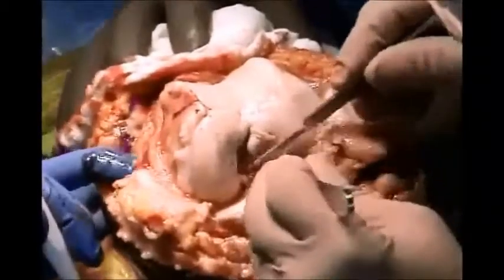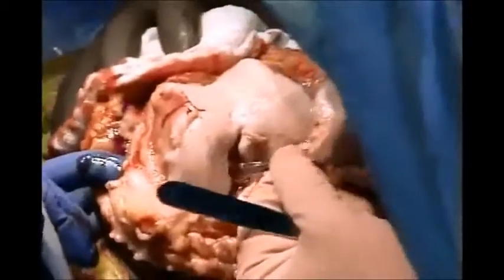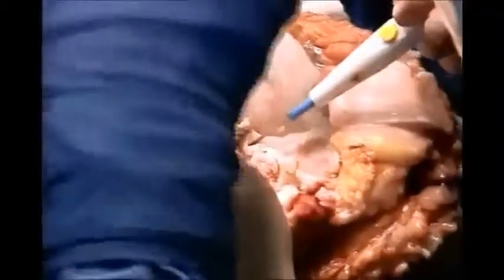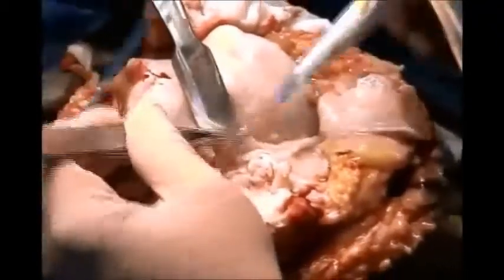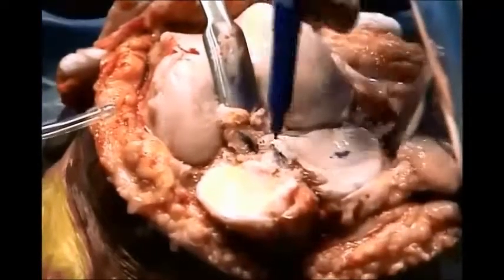After you do the arthrotomy, leaving about a centimeter cuff medially for suture of the quad tendon, you detach both posterior and anterior cruciate ligaments. I am showing here detachment of the posterior cruciate, and I have done the lateral meniscectomy.